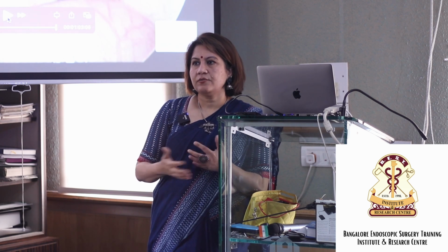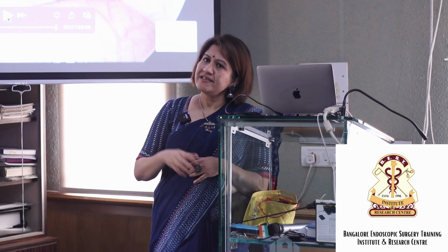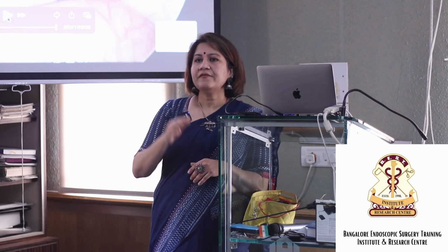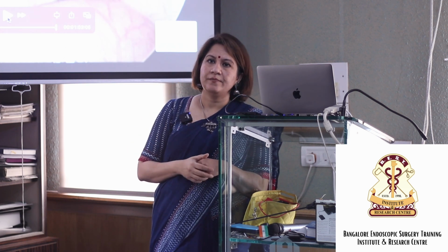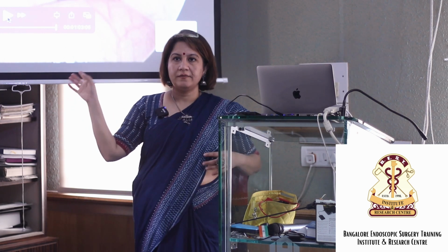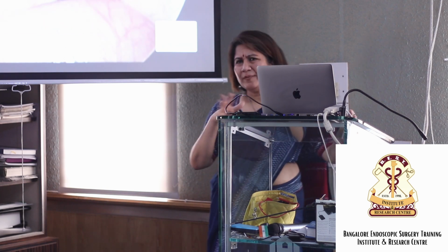Anything else you want to know? Do you have any pictures of monopolar electrodes? It's exactly the same as bipolar. It looks the same. The way you operate is the same. I think one of the myomas was monopolar only, the left myomectomy. There won't be any difference in the surgery or the way it looks. Only the loop will have 2 limbs in bipolar and 1 limb in monopolar.